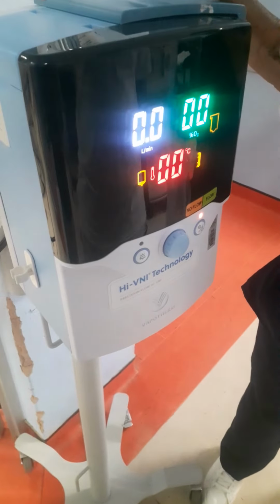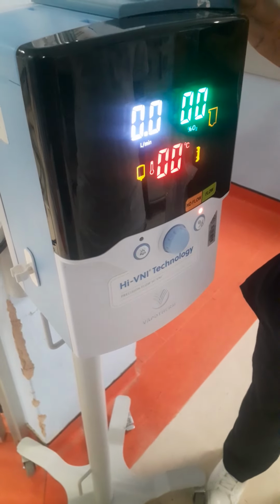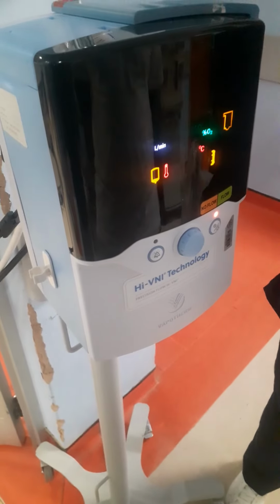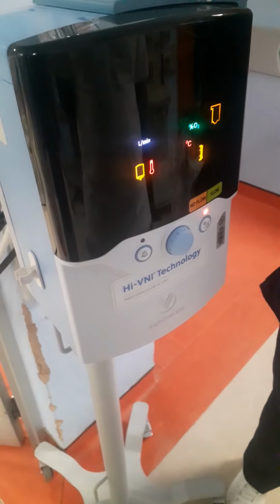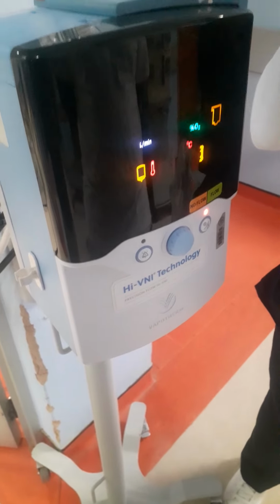But high flow gives you warm, oxygenated air. There's something called dead space in your lungs, the area of the lungs that does not participate in gas exchange. In patients who are struggling to breathe, sometimes it's too much mucus in the lungs.